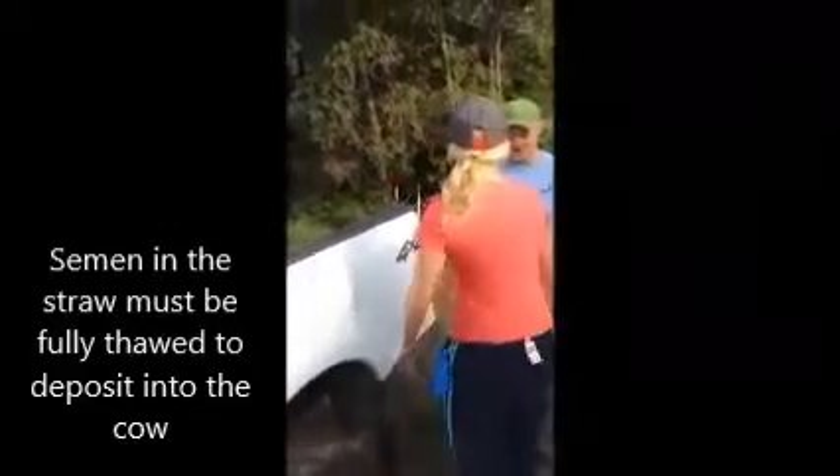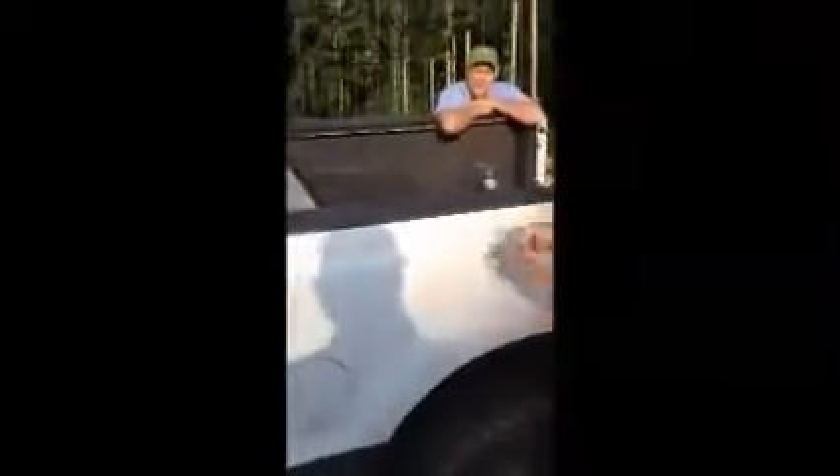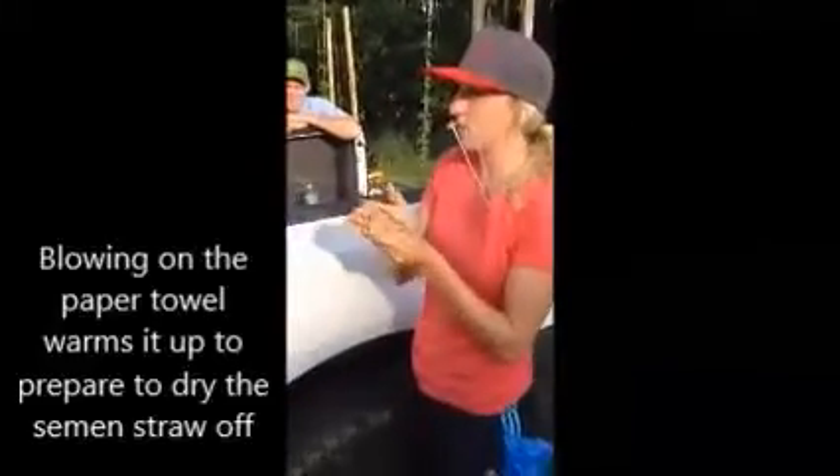And then while that's going on you want to get your gun and your sheath warm up to your body temperature. And your paper towel and your scissors. You just want to make sure everything is nice and warm for when you take it back out.